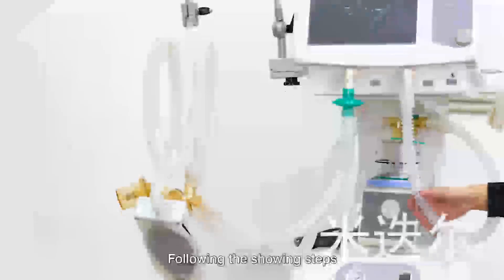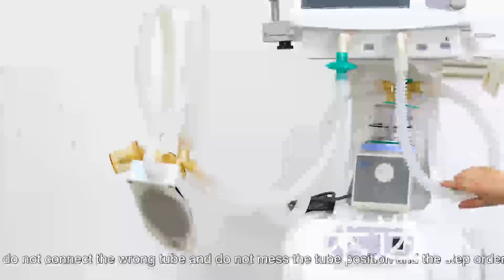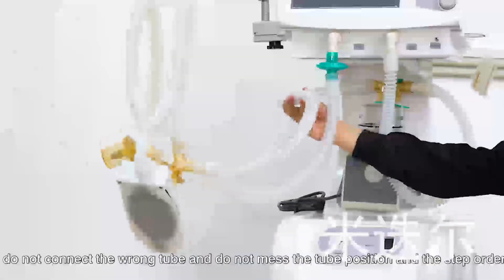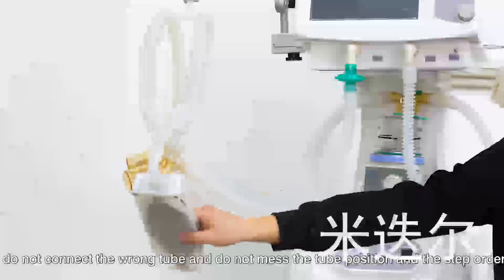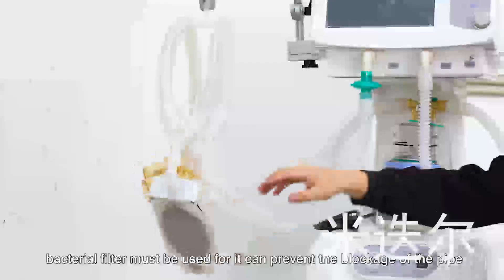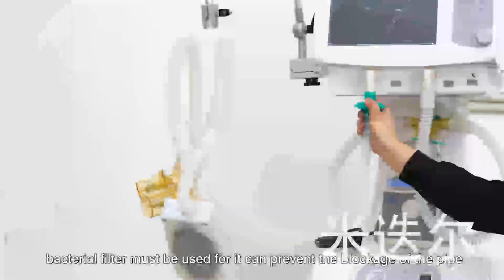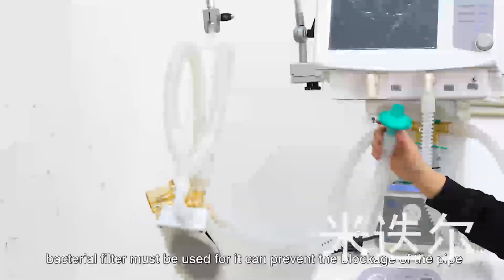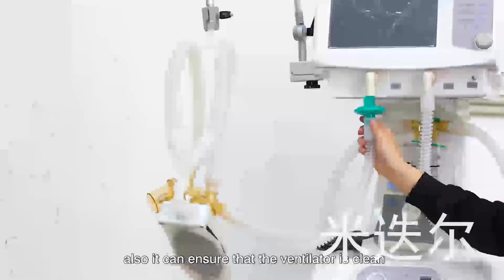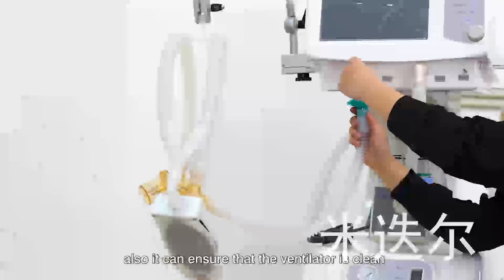Following the showing steps, do not connect the wrong tube and do not mess the tube position and step orders. Bacterial filters must be used, for it can prevent blockage of the pipe. Also, it can ensure that the ventilator is clean.